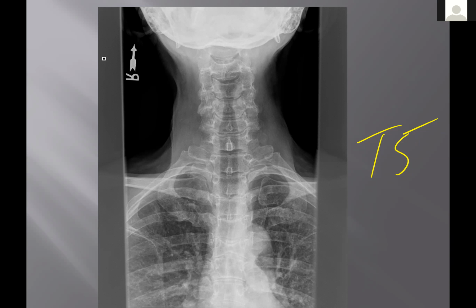So a butterfly vertebra, we never had that term when I was in school in the last century. But a butterfly vertebra is a bilateral hemivertebra, right? Yes, it is. You got it. It's a congenital/developmental condition, just like the hemivertebra that you brought up. And so it's not a traumatic compression fracture. It's wedged, but it's wedged developmentally or congenitally.